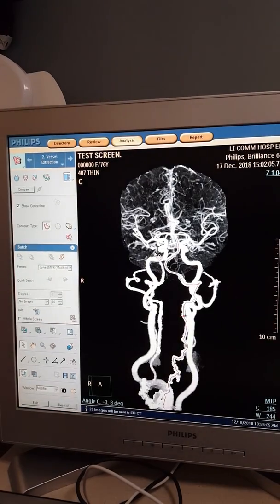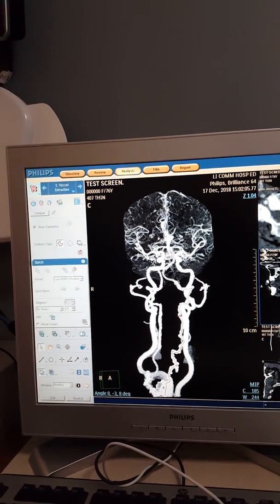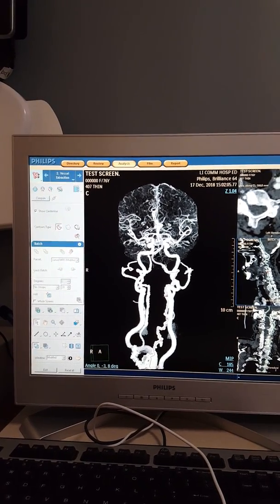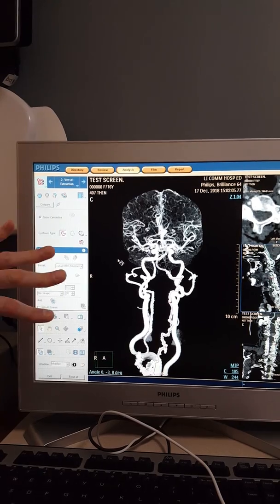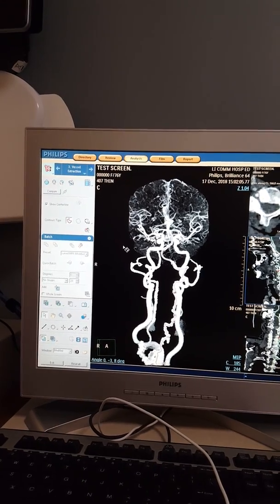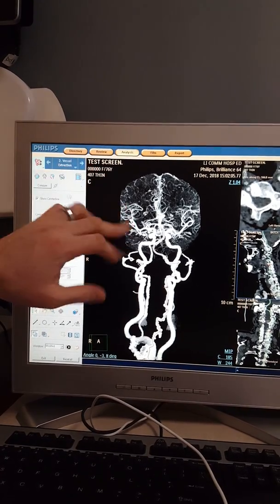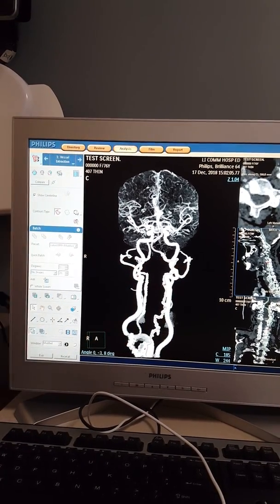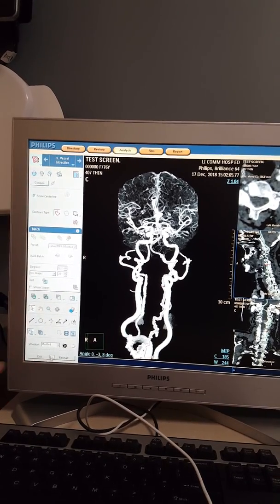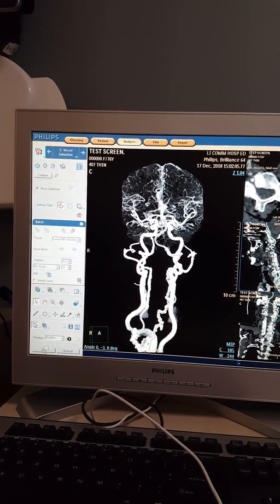Batch, curved MPR, 20 images — preview if you want, just like before, it spins nicely — save and OK. Now we're done. Those are the things you're concerned with: rotating left to right, going anterior to posterior with just the brain, then doing vessel extraction for your six vessels for a head/neck angio, or just a head angio — always good to include a little bit of carotids. Down here you can exit out — don't reset, as it'll reset everything you did. Just exit.